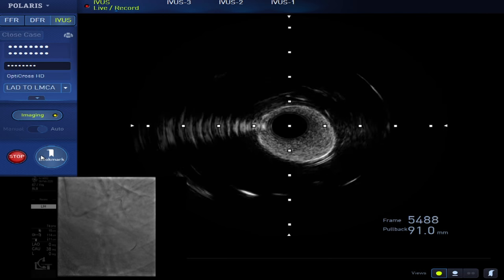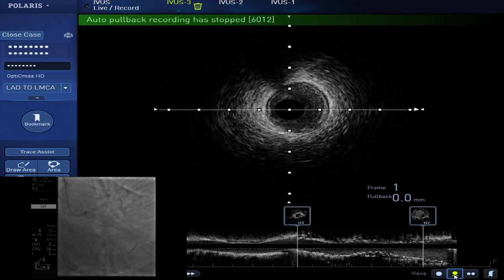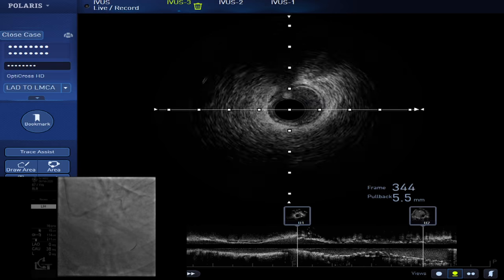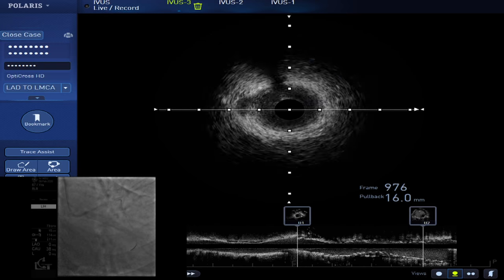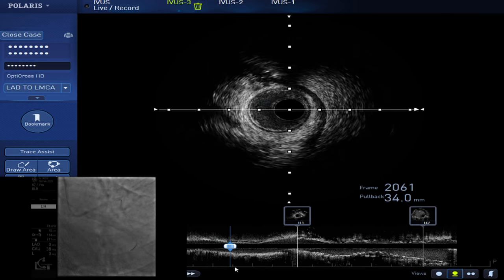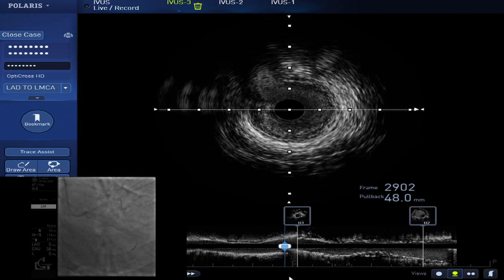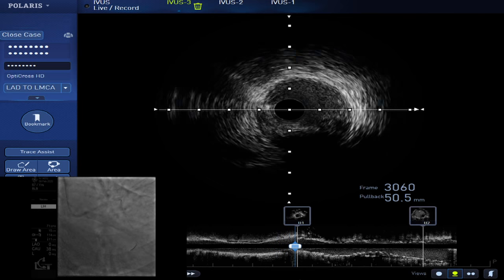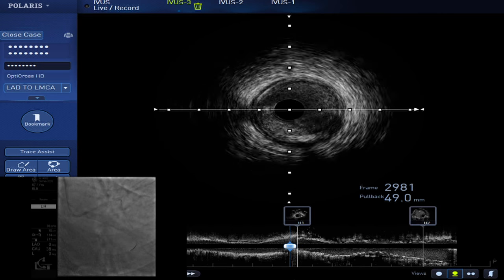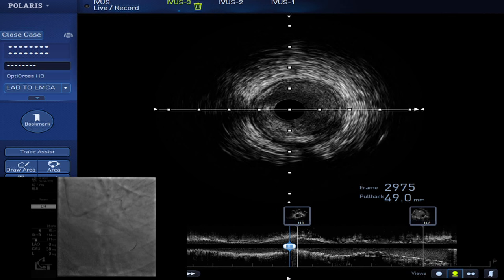It's good. So do you suggest another stent, short stent implantation at the distal part or not? I think it might be okay. Yes, small amount of plaque, but it's fibrous and there is no dissection at the edge, so we can leave it alone. Okay, right there. So now it's time to take angiography after injecting the nitro.